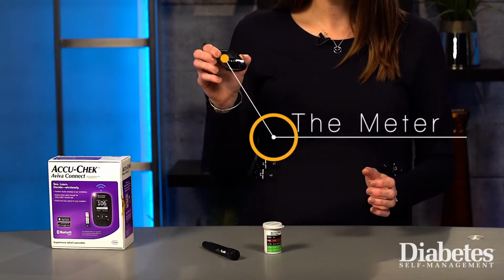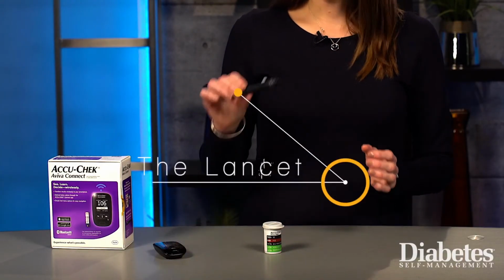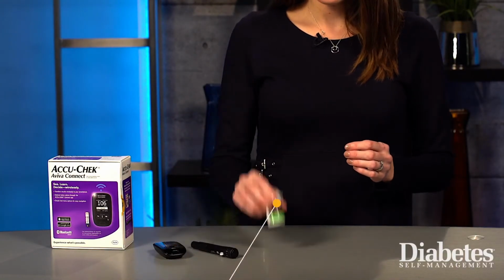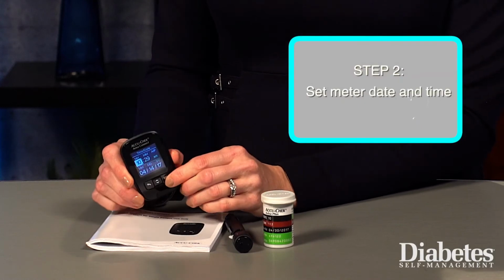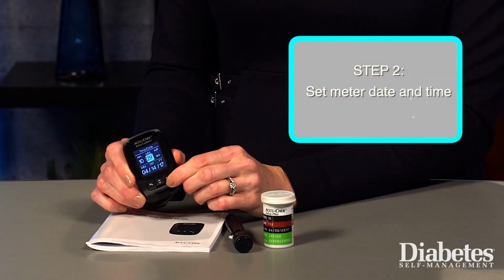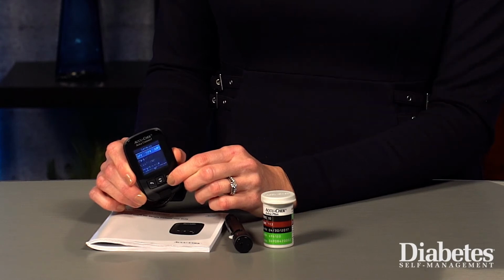So how do you monitor your blood glucose levels exactly? Your glucometer kit will come with 3 different parts: the meter, the lancet, and the test strips. Step number 1 is washing your hands with soap and water. Next, if you're starting to use a brand new meter, you'll want to set it up with the correct date and time. Each meter is different, but the instruction guide should tell you how to set this information up.